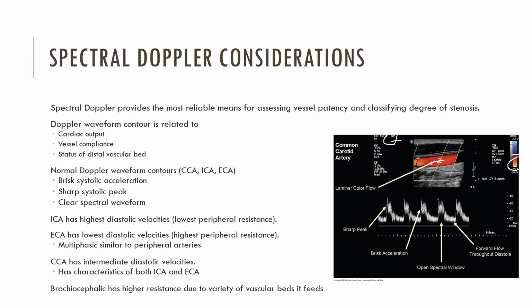Now, if I'm going to go in and take my measurements for my common carotid, external and internal carotid, as well as my vertebral, I'm always going to measure at the maximum here, the peak systole, and right here for my end diastole.